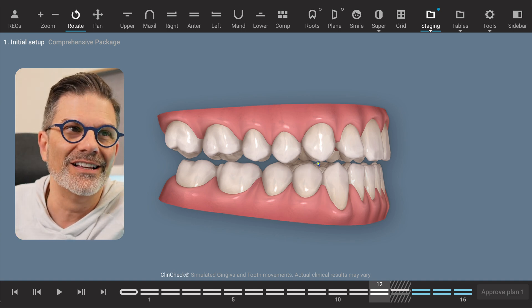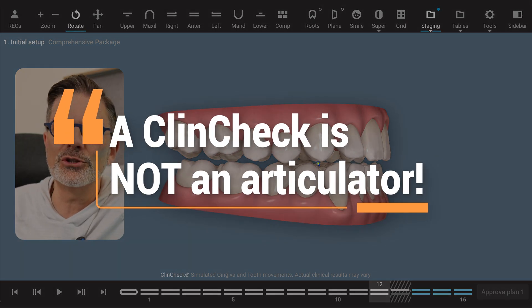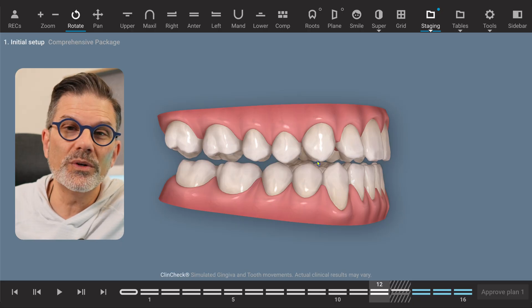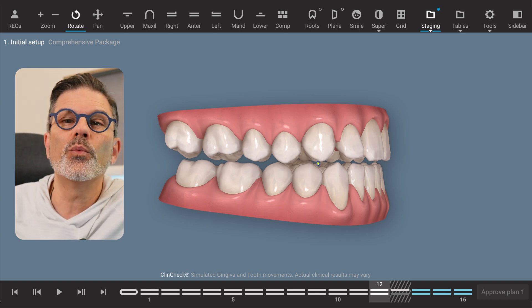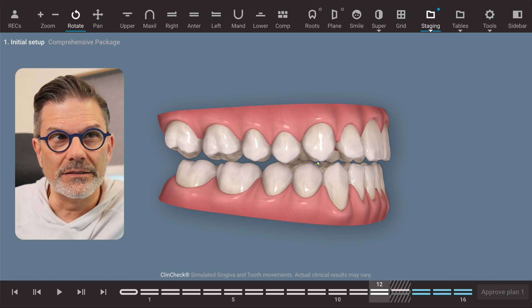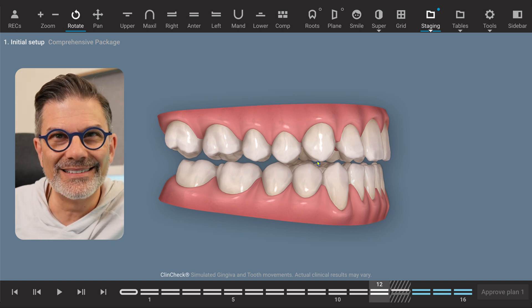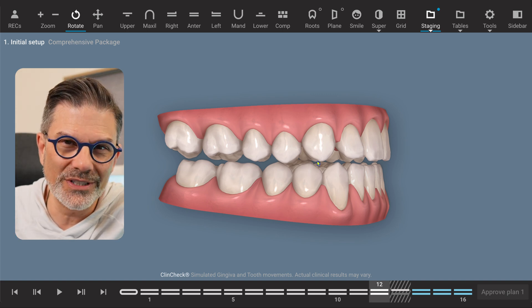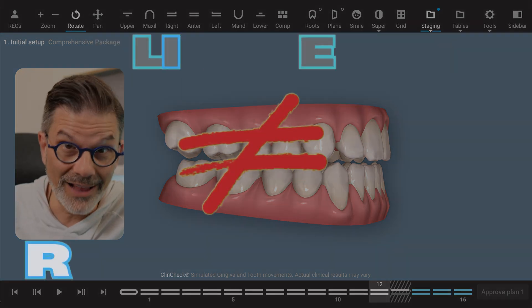A ClinCheck is not an articulator. The only occlusion you can look at that makes sense on the ClinCheck is the initial occlusion, not the final occlusion. This is why you will often see — and the more complex the case, the more you will see it — what we call over-engineering, or over-correction. What it means is we exaggerate movements on the virtual setup because we know this is not exactly how the teeth will move. So there's a difference between a ClinCheck and a reality check — what you see on the screen is not what you get.